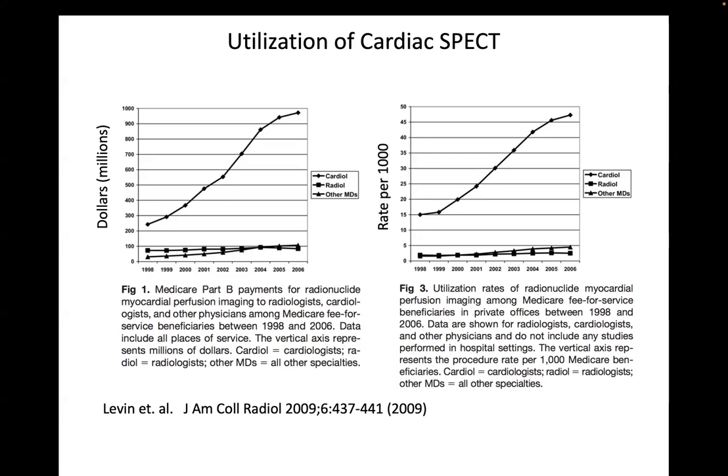Here, what's going on is that this imaging machine, over this time was available in the cardiologist's office. So it was extraordinarily convenient for both the cardiologist and the patient. They didn't have to send them off to some hospital and go into the radiology department and get a scan. They had this machine in the back of their clinic, right? And so there's very little negative feedback for getting the test. Right? You want to see that information. The machine's right there.